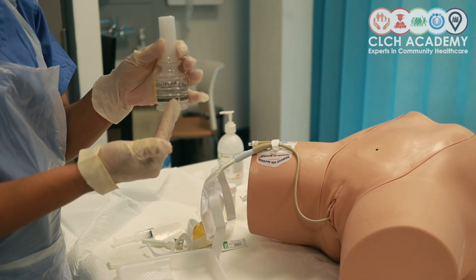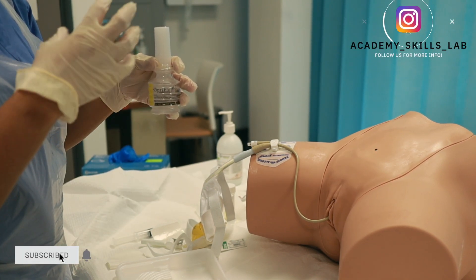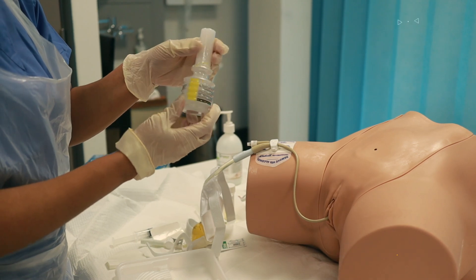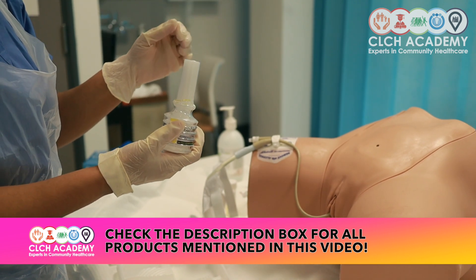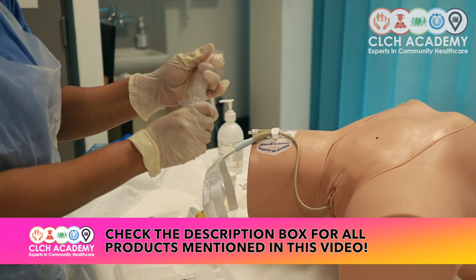They've got the one that's actually for slightly stronger sediment — more debris, quite a lot of bits in the urine. So you could always look to see which one is indicated for your patient. Mine is only slightly concentrated with minimum debris, but I feel my patient needs a flush at this point in time.